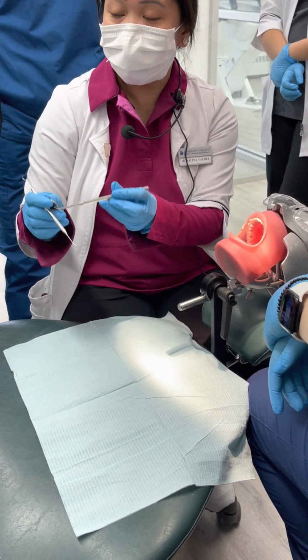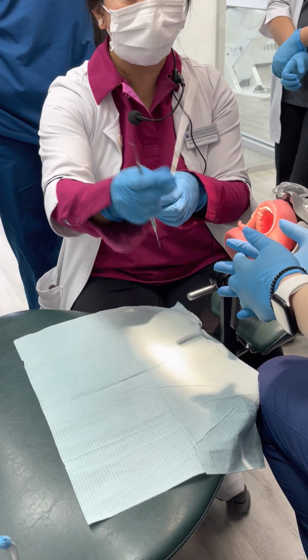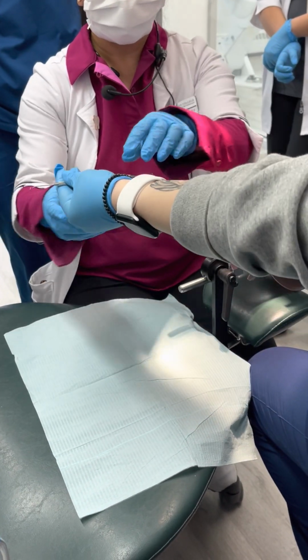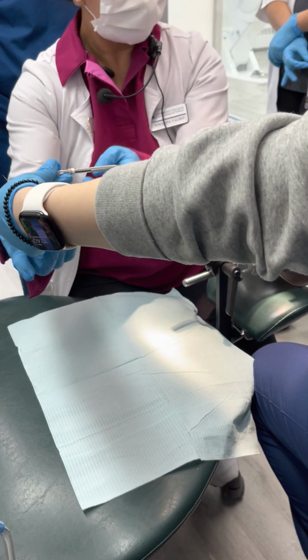Now, you're gonna hold 25% of the instrument because you're paid less. I'm paid more, so I'm holding more. So you hold it like this. Look at my fingers. Very good. Not too far.